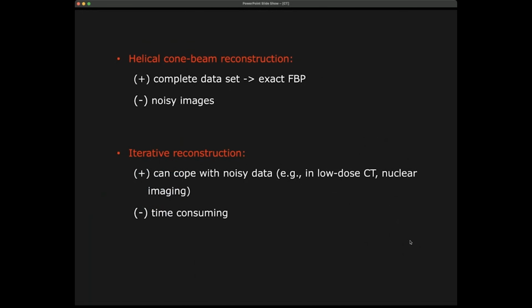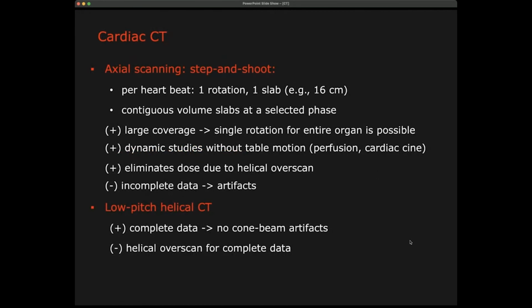Okay. So that's what I told you before. All of this can use iterative reconstruction, which is better at coping with real situations, so with non-ideal scanners, but of course it is time consuming.